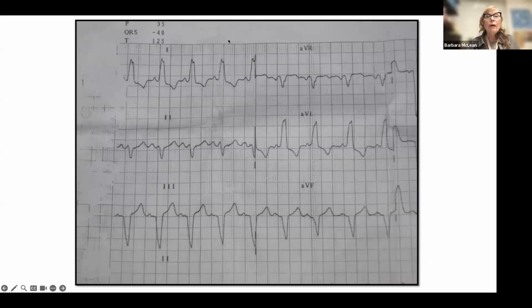Okay. Now here, all I'm seeing are the limb leads. So if I'm looking at axis, I can see in my limb lead upright in 1, pointing to the left, but downwards in F, so pointing away from the foot. So upright in 1, downwards in F means current is going to the left, but away from the foot. And this is a left axis deviation.